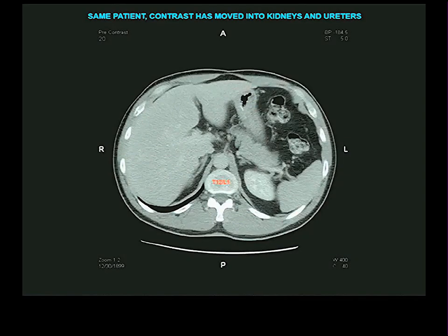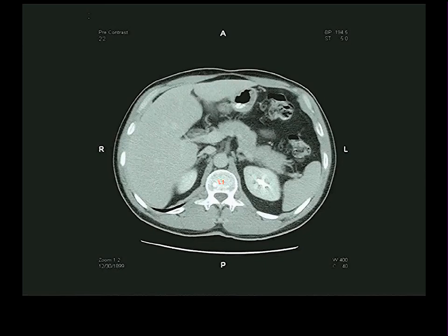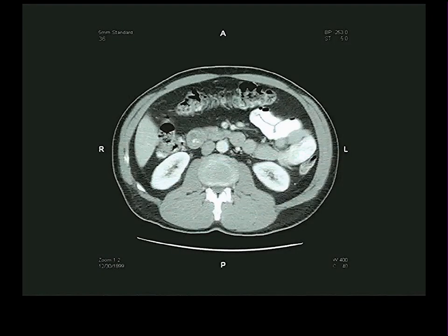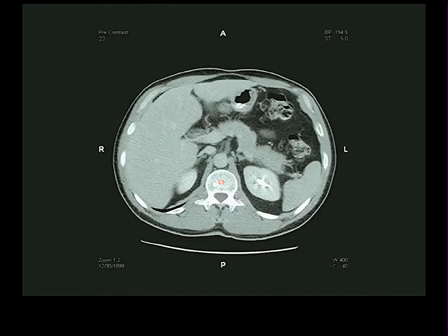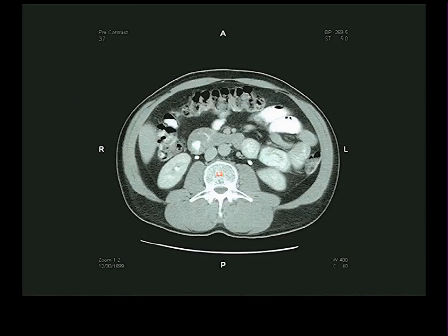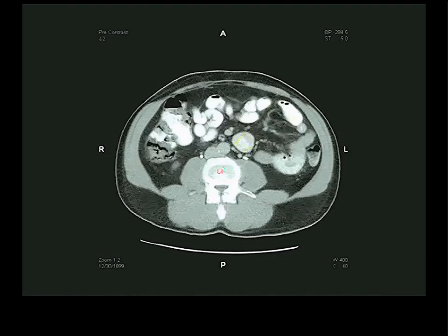All right, here we go. You wait a little while, and all that contrast that you injected into the person is removed by the kidneys and enters the, you don't know anything about kidneys, so it enters the excretory system of the kidneys. So remember, higher up in the other sections are the earlier sections. Look at how the kidney is very white because all of the intravascular contrast is in the tubular section of the kidneys being removed by them. When you go later in time, that's what the next series is, the kidney cortex and medulla is not so white. The contrast is actually in the collecting system. This is a major calyx, pelvis of the kidney, and that just will turn into the two ureters. It will be nice and bright and shiny white with all the contrast as they travel down the anterior surface of the psoas major. You'll see that today in the lab. Not to go into that anymore.